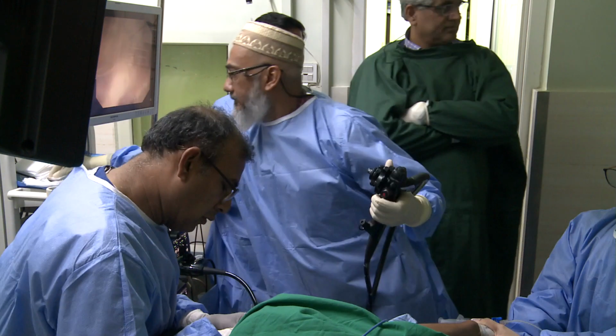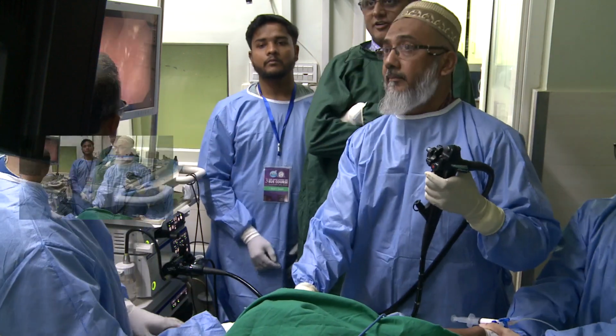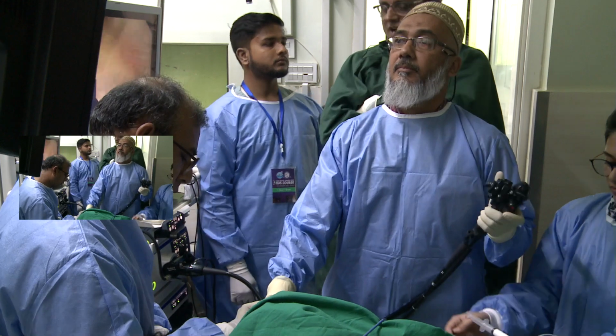Okay. D1. Yeah, go ahead. Straight to D1. We have a young 47-year-old.